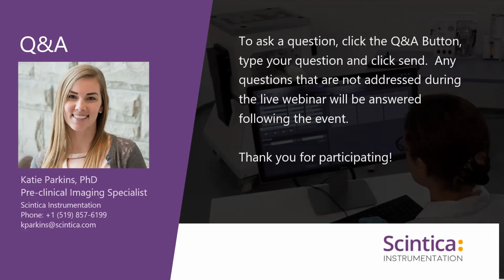And so how deeply below the probe surface can you acquire an image? Theoretically you can go up to 400 micrometers, but because bone has really thick optical density, I think we could go up to 180 something. Sorry, you said 180? 180, yeah.